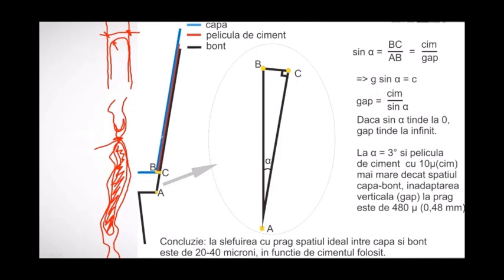So when does it happen? When you suppose that you don't need space for the cement. You don't have to have direct friction between the crown and the abutment. It has to go smoothly, nicely, and sit only on the shoulder. You remember in all the movies the technician was applying the foil of wax and then the spacer, in order to give enough space for the cement. Now this is very important, what kind of cement you're using. You have to know if it's 20 microns, 30 microns, 40 microns, maybe 17 microns.